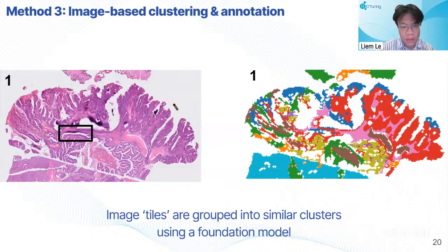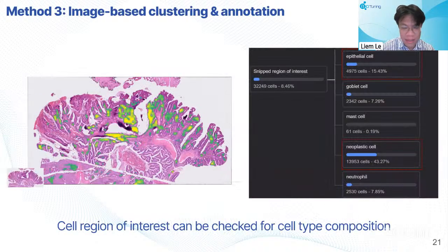Right. So I believe it's in the next slide. So again, this is a summary and also what we found. Once you snipped out a region of interest, you can find all the cells on that picture that are of the same cell type using image-based clustering. And selecting those cells, you can visualize them on SpatialX as well, on what cell types could be there using the first method of prediction.